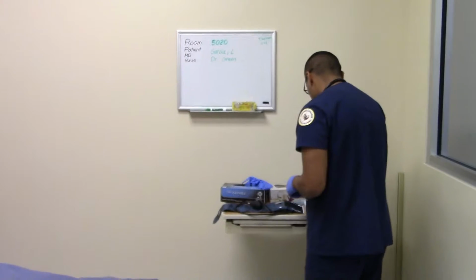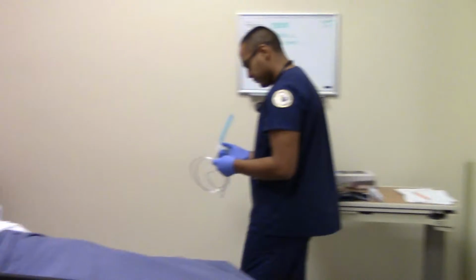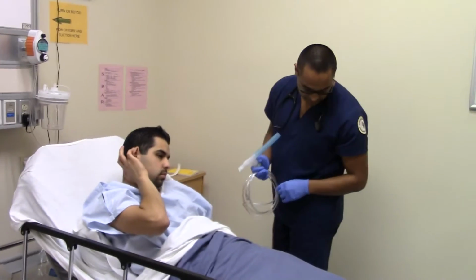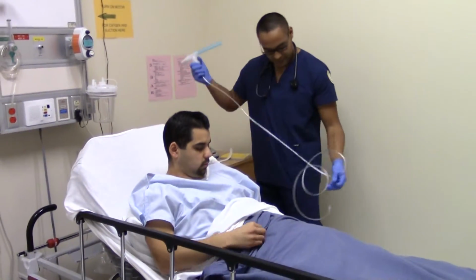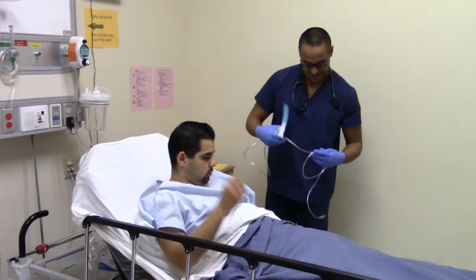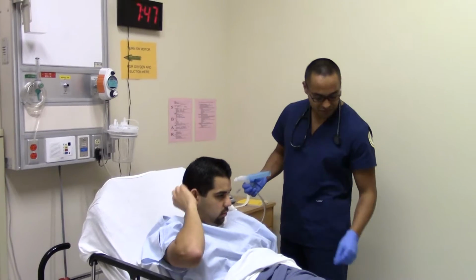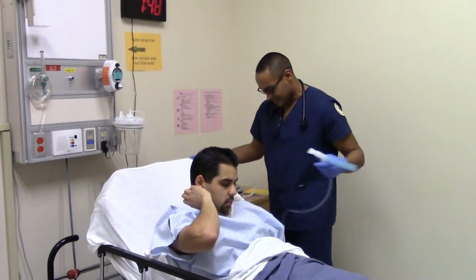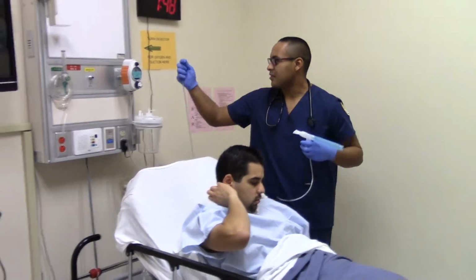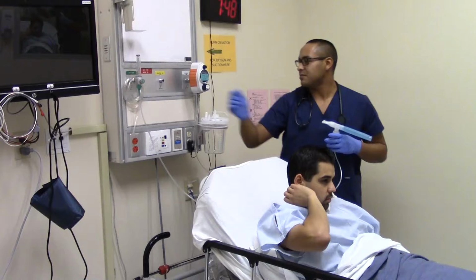All right, Christian, I'm going to go ahead and start the treatment, okay? All right. Looks good. Yeah, I heard some wheezing on your bottom left lung. So I'm going to go ahead and hopefully it goes away. Okay. I'm here for you. That's my job.